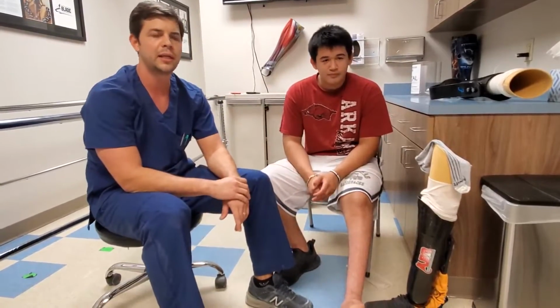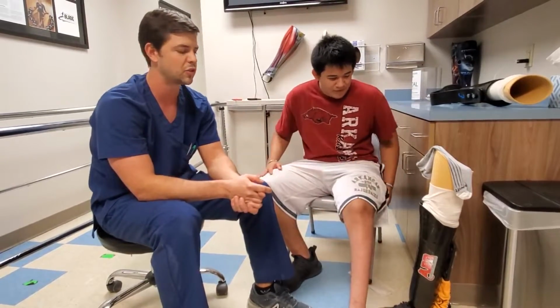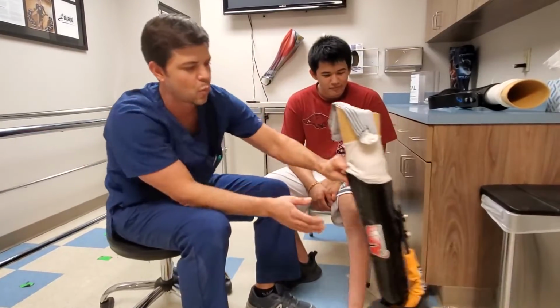So he got here Sunday, and we took a new cast of his leg. We fit a bivalve Vivac check socket just to check for volume. And from that Vivac socket, we first did a walking leg.